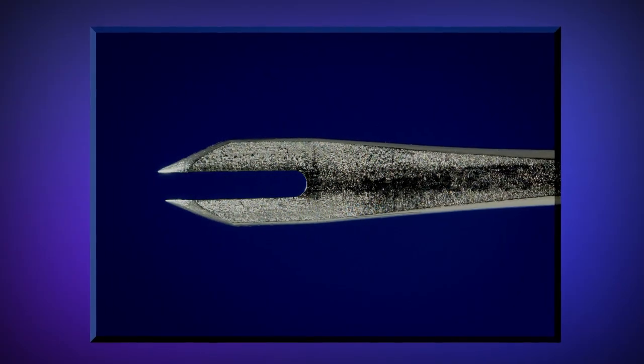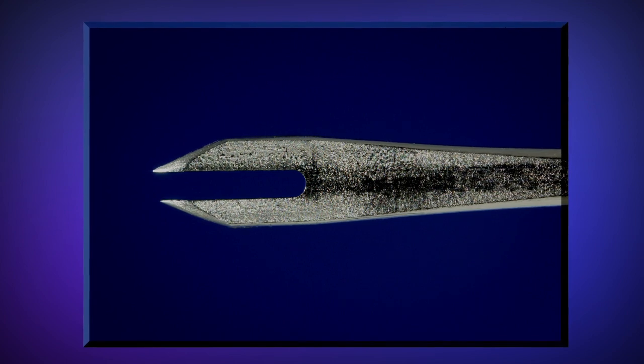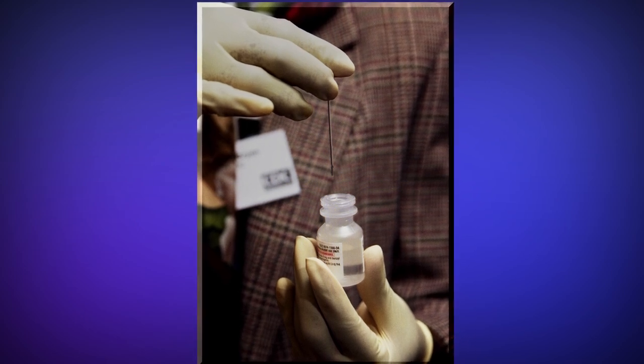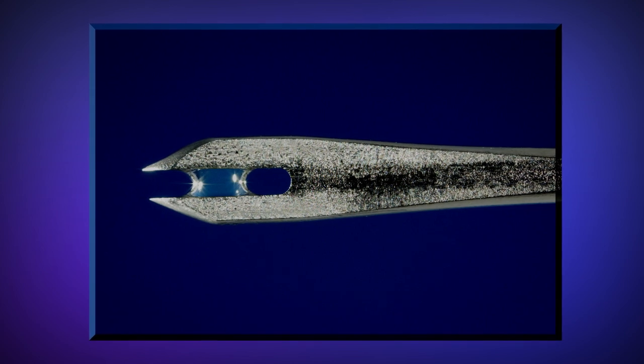Don new gloves before each patient contact and remove the stopper from the reconstituted vaccine vial. Remove the bifurcated needle from its packaging. Be careful not to touch the bifurcated pointed end. Submerge the bifurcated end of the needle in the reconstituted vaccine solution. The needle will pick up a droplet of vaccine within the fork of the bifurcation. Do not insert the upper part of the needle that has been in contact with fingers into the vaccine vial, and never re-dip the needle into the vaccine vial if the needle has touched skin.